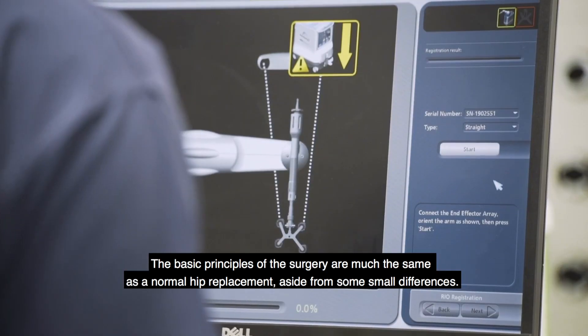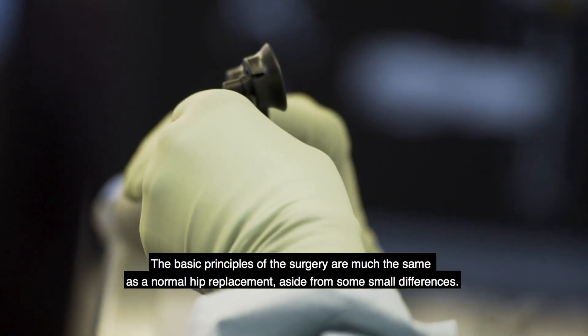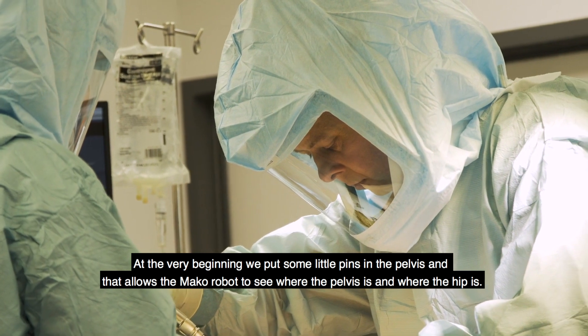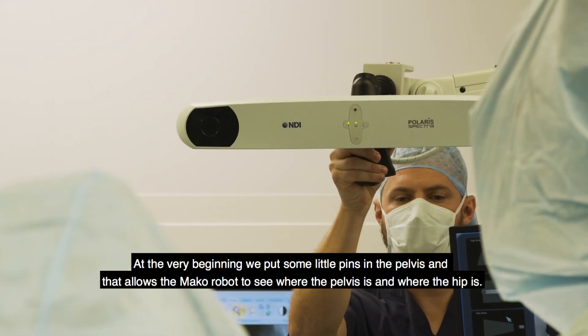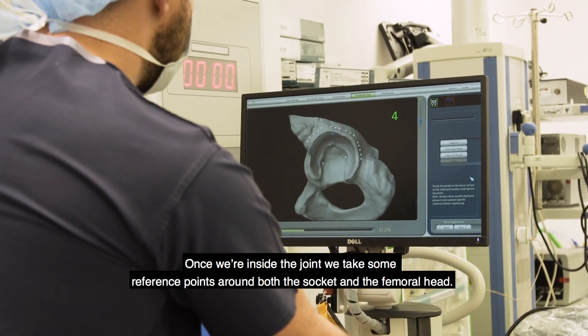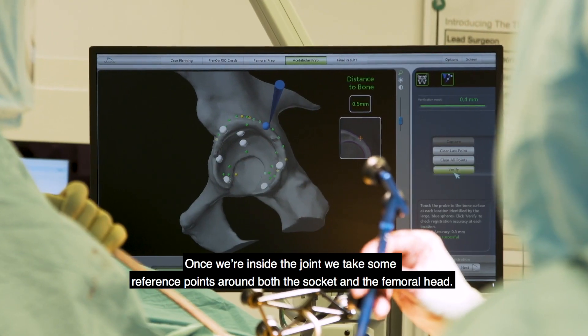The basic principles of the surgery are much the same as a normal hip replacement aside from some small differences. At the very beginning we put some little pins in the pelvis, and that allows the Mako robot to see where the pelvis is and where the hip is. Then once we're inside the joint we take some reference points around both the socket and the femoral head.